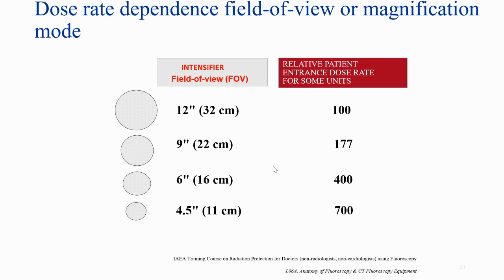But with a digital detector, you can use it, because you are not using an image intensifier. With an image intensifier, collimation highly affects the brightness of the image, so the automatic brightness control will try to increase the brightness by increasing the patient dose.